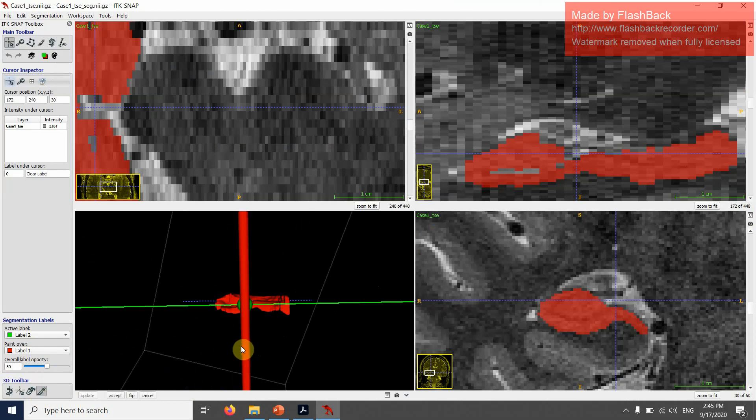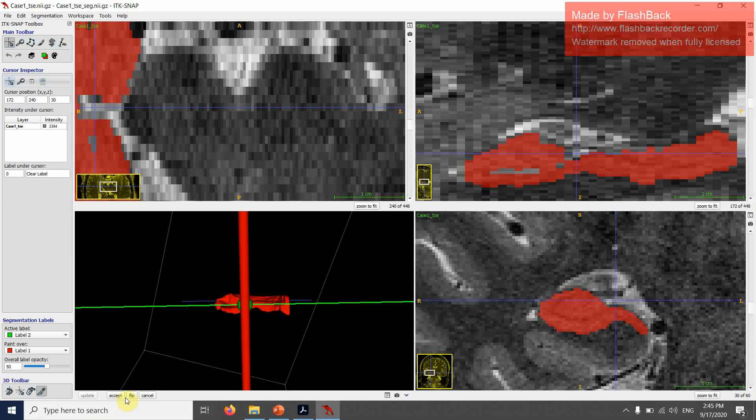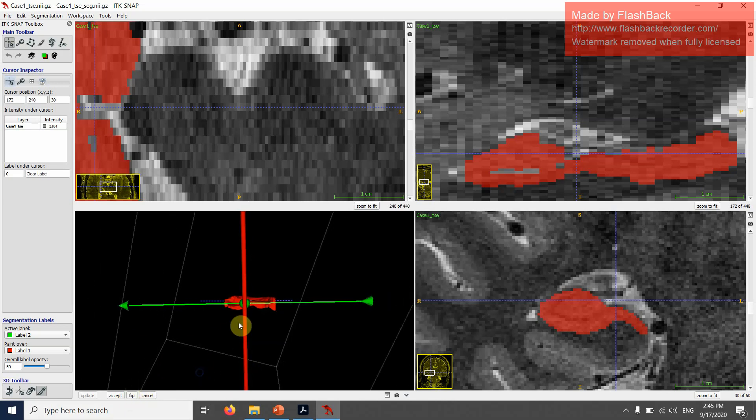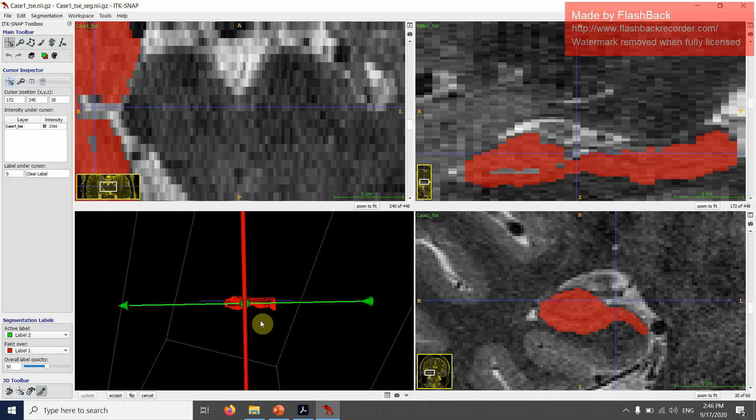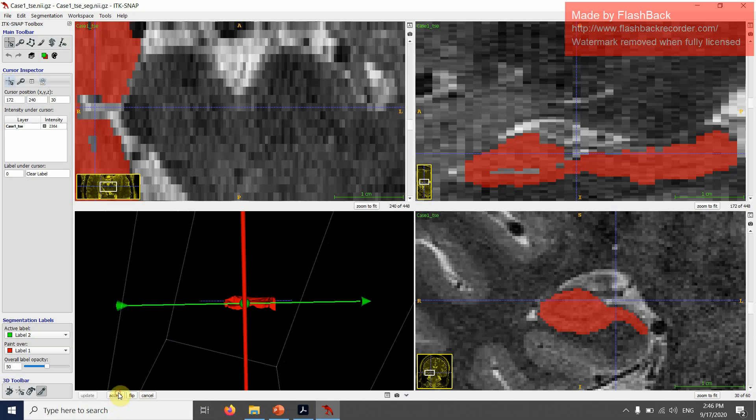You can see the arrow indicating this direction, but I don't want to color over this label. I want to color over this, not color over this part, but I want to color over that part. So I do flip, accept and then update. You can see that now the posterior region is green.